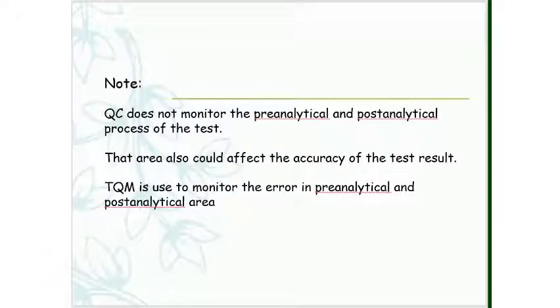So take note that QC does not monitor the pre-analytical and post-analytical process of the test. That area could also affect the accuracy of the test result. Therefore, total quality management is used to monitor the error in the pre-analytical and post-analytical area.